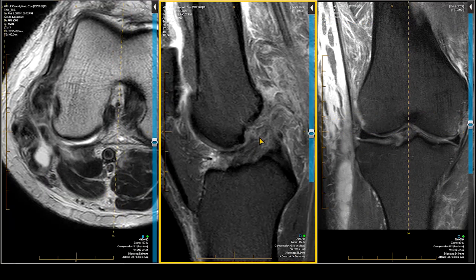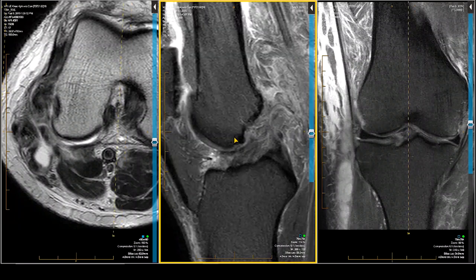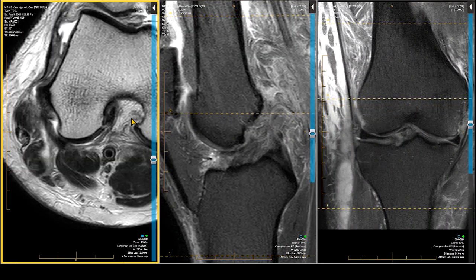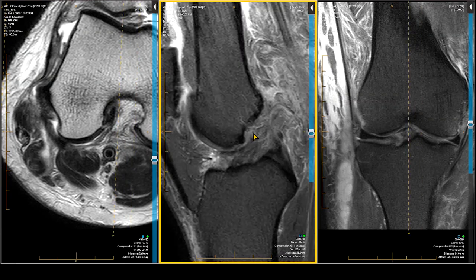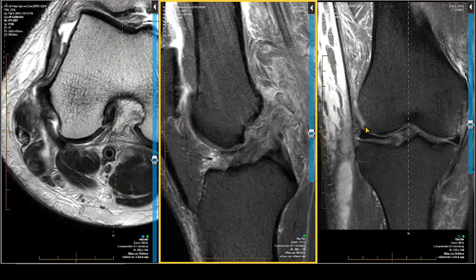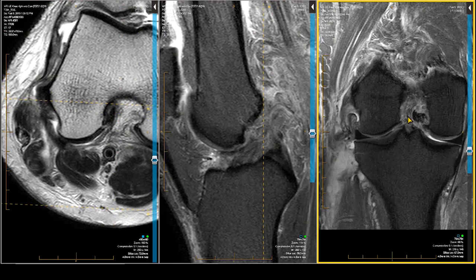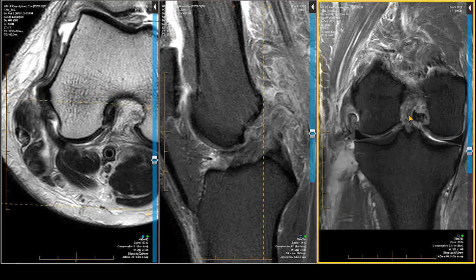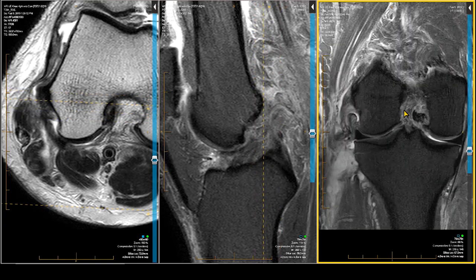Let's go back to our sagittal. Am I confident enough to say this ACL is blown? You bet. I've got it in three projections — certainly in two. The proximal end is looking pretty bad. Those fibers and those fibers are not connected. It's actually easier to see in the coronal.